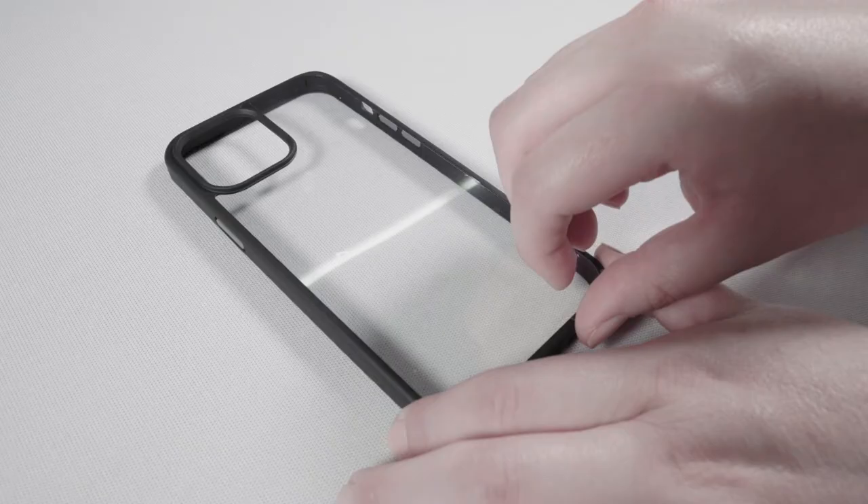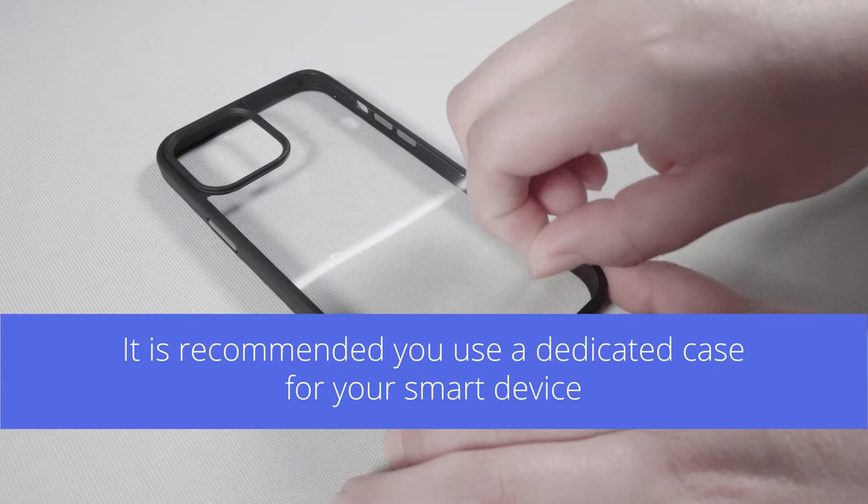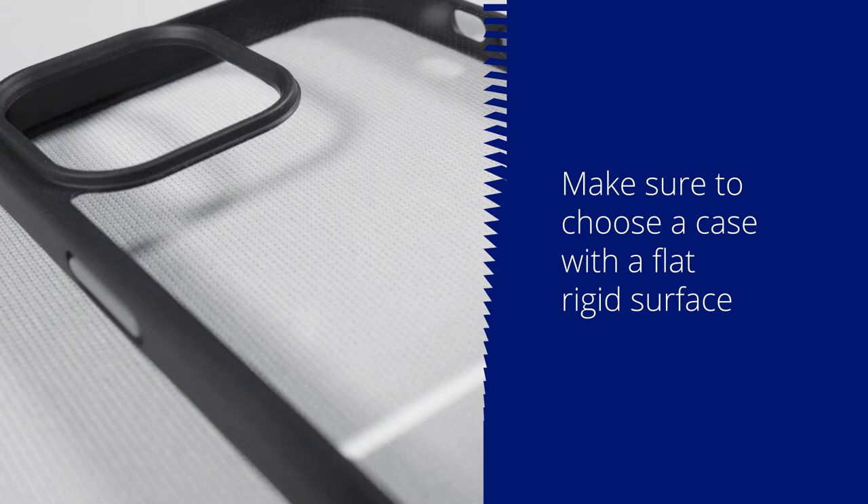It is recommended you use a dedicated case for your smart device. Make sure to choose a case with a flat rigid surface. Here are examples which will not work: not rigid, not flat, and has texture.